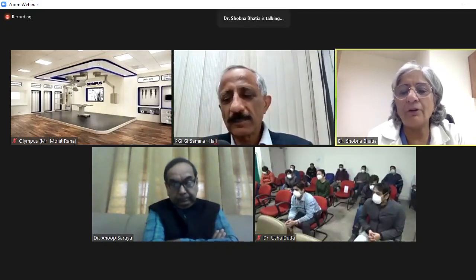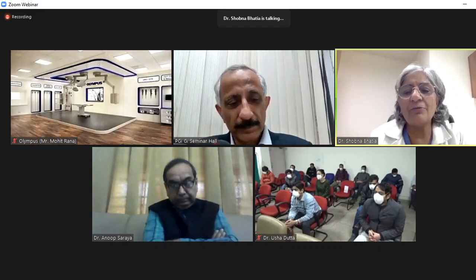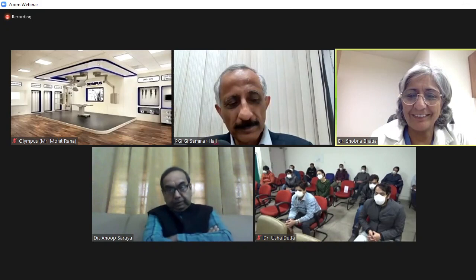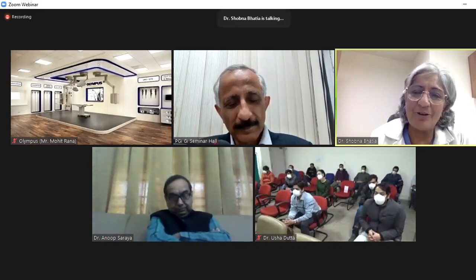Okay, so now Praveen Rao has a very nice question. What is the difference between a nodule and a polyp? So essentially, I think we're talking about sessile polyps. When will you call it a nodule?